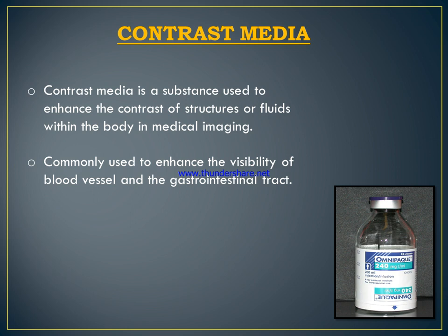In contrast media, we use non-ionic contrast media, like Omnipaque and Contrapaque. There are many types of contrast media. Contrast media is a substance which is used to enhance the contrast of structures or fluids within the human body. Commonly, it is used to enhance the visibility of the blood vessels and GIT.